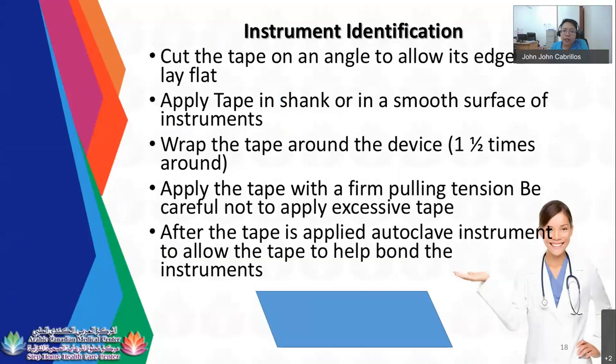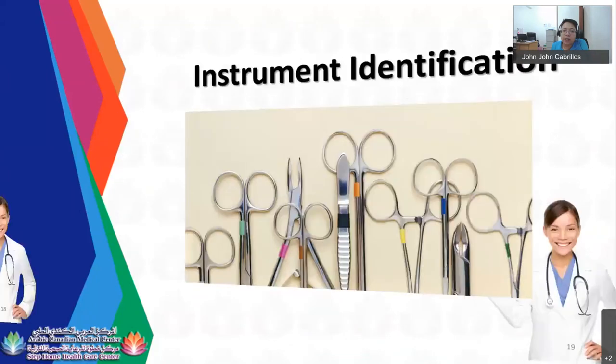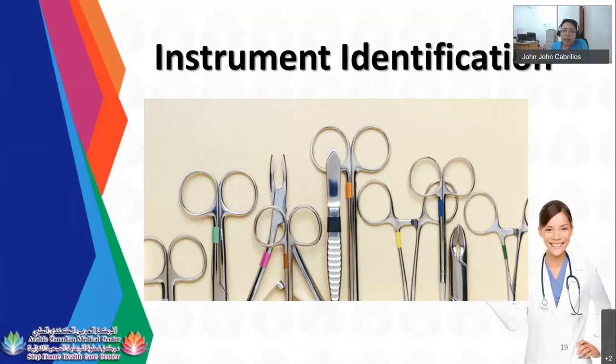After the tape is applied, autoclave the instruments to allow the tape to help bind to the instruments. So once you are done, you can autoclave the instruments and your autoclavable tape will stick to your instruments. So this is the sample of your instrument identification. It depends on your facility, but as you can see, it is on the smooth area, mostly on the shank.